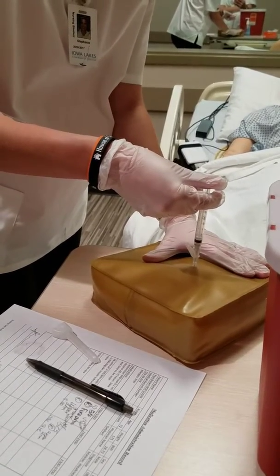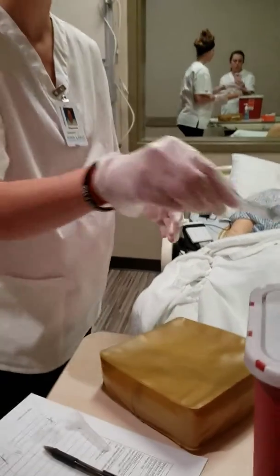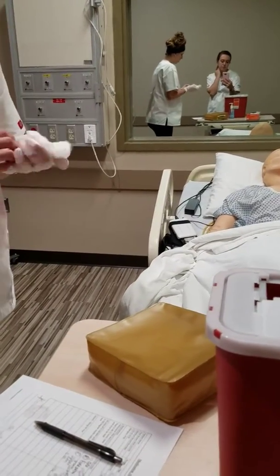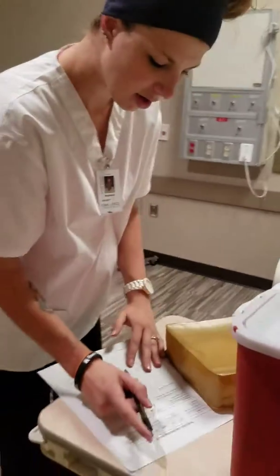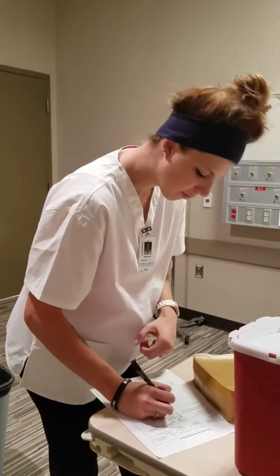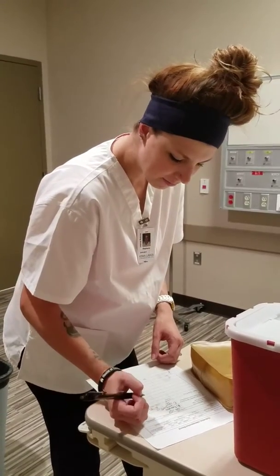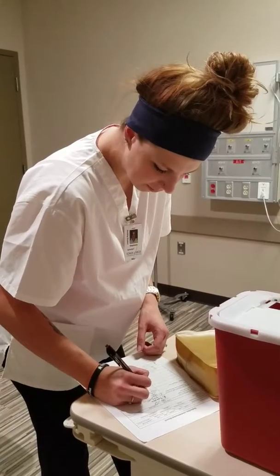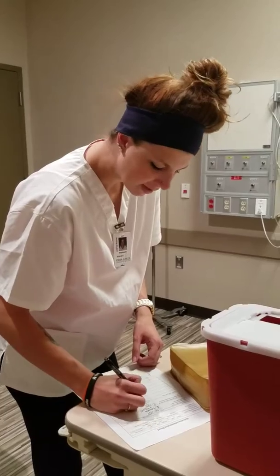Inject it slowly. Put the safety on. Dispose in the sharps container. Go ahead and document that we gave that at 1544 in his ventral gluteal area on the right side.